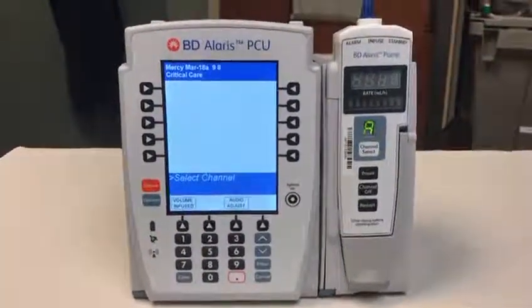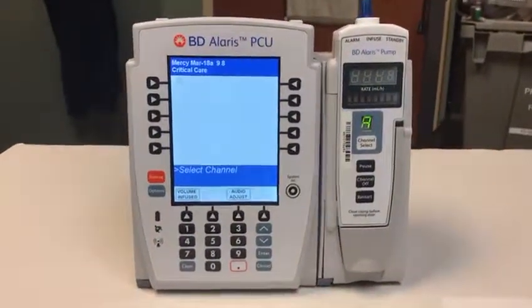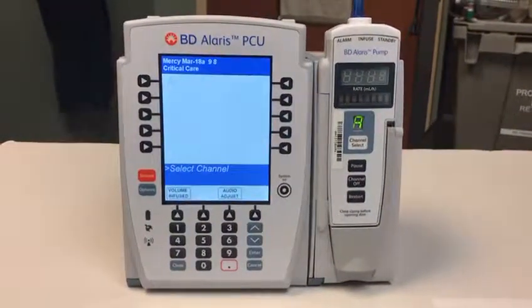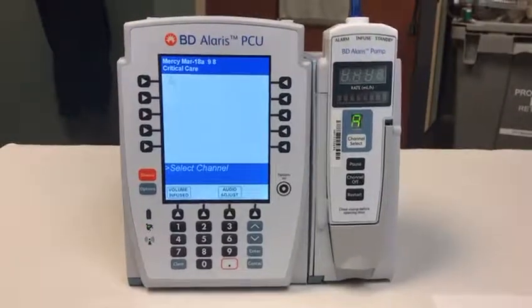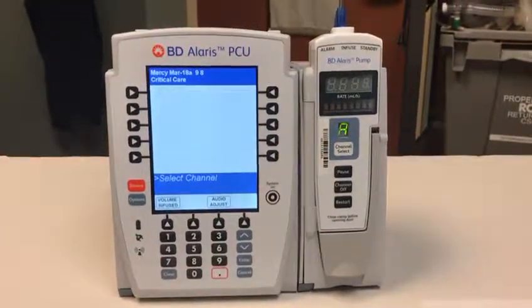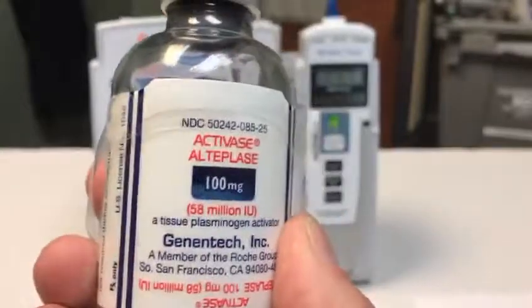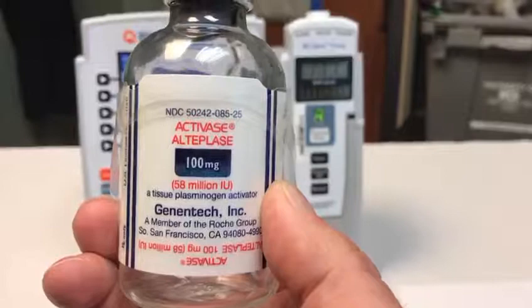In this video, I'm going to discuss how we initiate a TPA infusion or alteplase infusion for a patient diagnosed with acute pulmonary embolism. Now, this procedure is going to be different than what we're used to for stroke patients. Unlike stroke patients, the pharmacist will not provide two syringes with the TPA. Instead, they will reconstitute the medication in the vial itself and provide the actual vial to the nurse. So this is the actual alteplase or TPA that contains 100 milligrams in 100 mils.